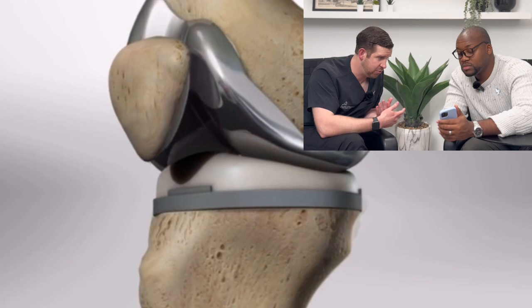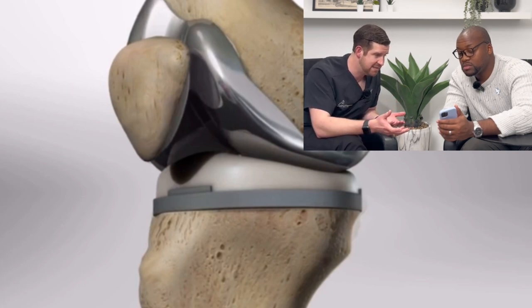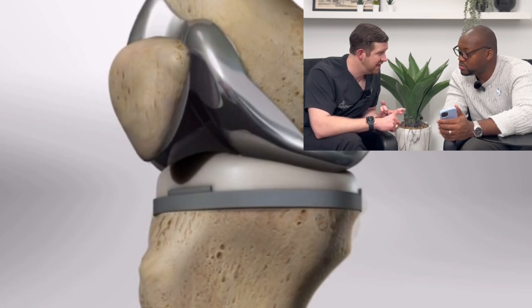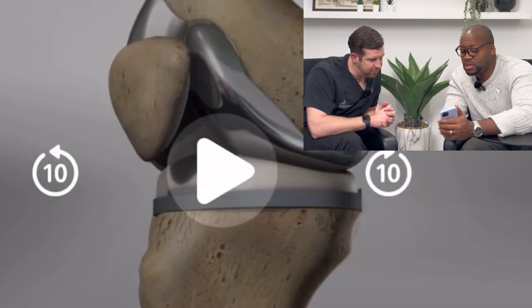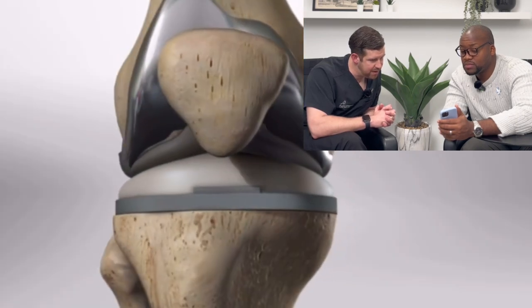There are some tendons that are either worn out from arthritis or we have to remove to place pieces in, but typically all of your tendons we keep. Usually the ACL has to be sacrificed or is already gone. But the PCL — the way I do it — we like to keep it as much as we can. Your MCL or your LCL, we keep those unless they're worn out. So that's the patella up front, femur up top, tibia on the bottom.